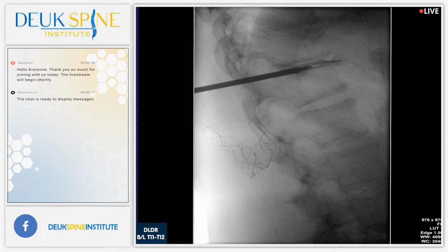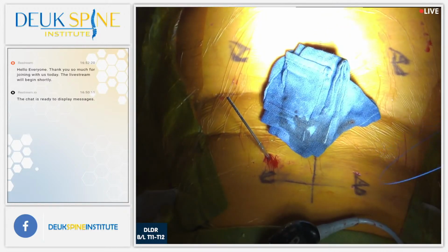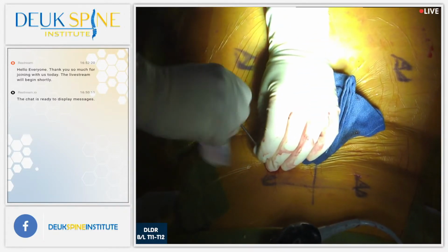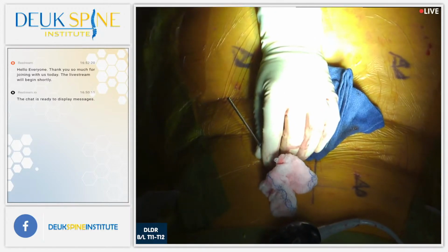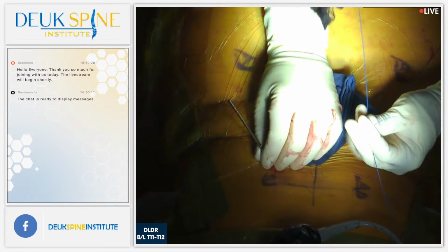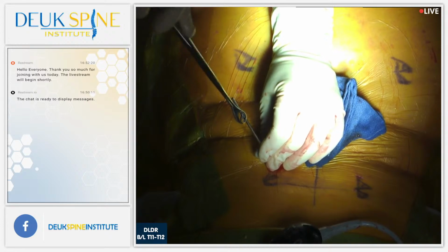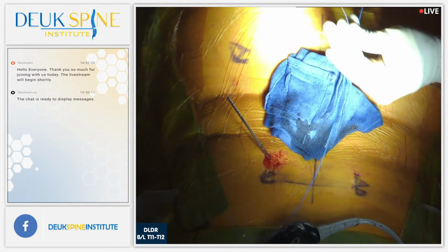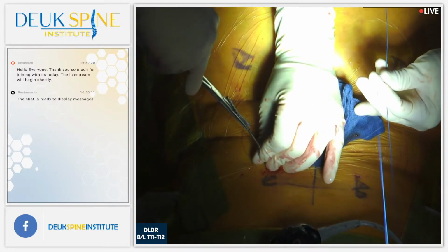Very good. We're in. It's okay, leave the other one too. We are in. I got this. You just work on that. Got to take my dilator out. Coker. It's gotten wedged in there. Let me have that. Just work on the other stuff. I don't know if this is going to work. It's a little too flimsy. All right, we're going to try to pull this out with our coker. There we go.